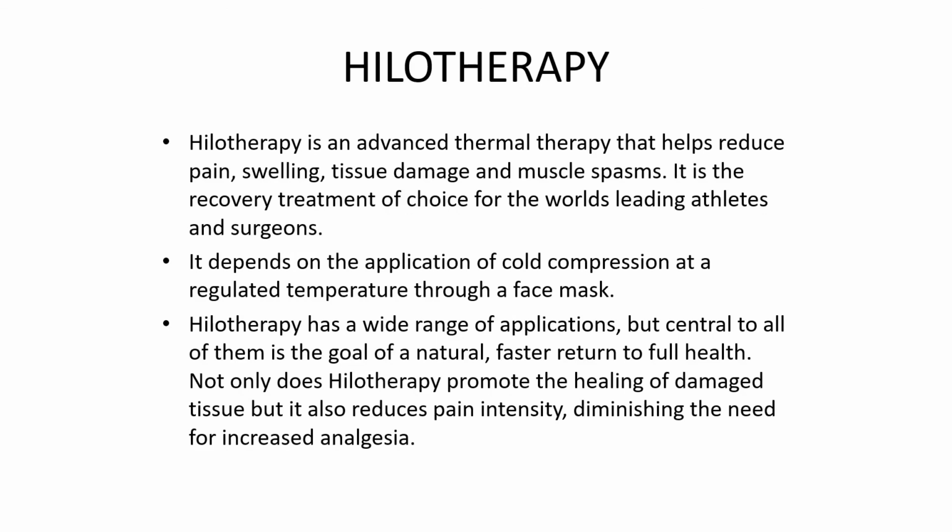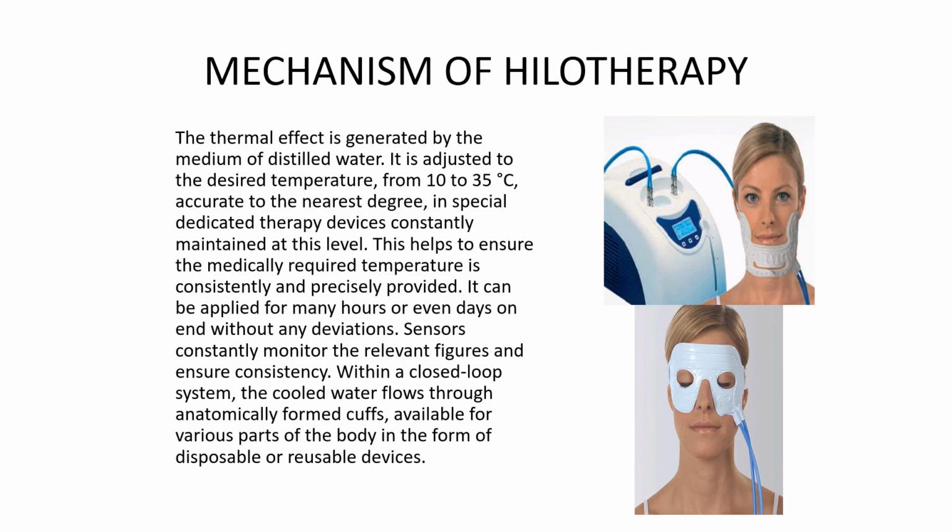Mechanism of hilotherapy. The thermal effect is generated by the medium of distilled water. It is adjusted to the desired temperature from 10 to 35 centigrade, accurate to the nearest degree, and special dedicated therapy devices constantly maintained at this level. This helps to ensure the medically required temperature is consistently and precisely provided. It can be applied for many hours or even days on end without any deviations.